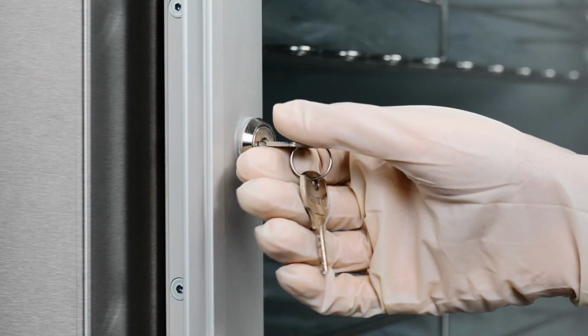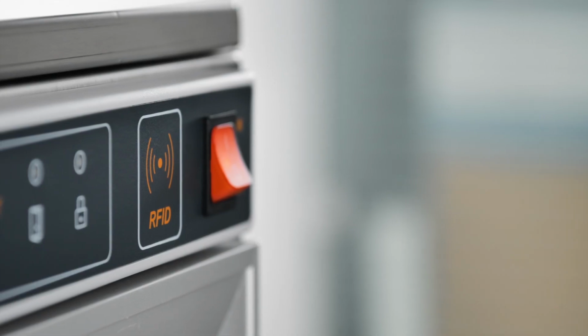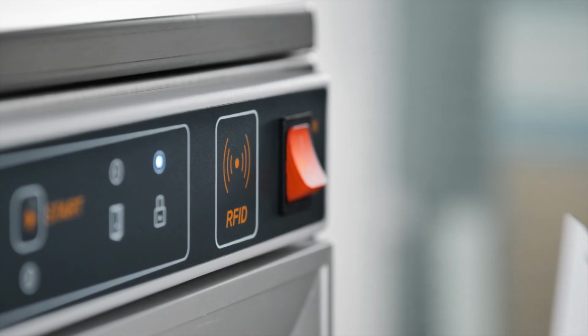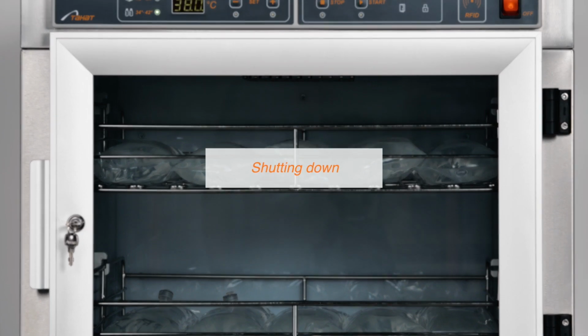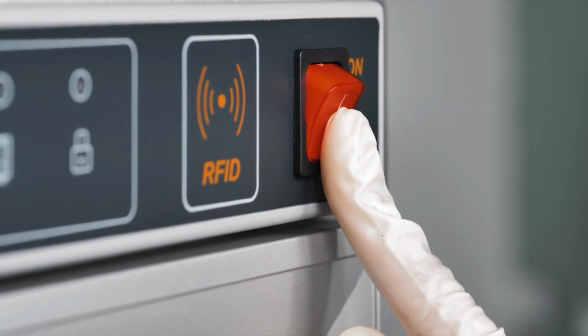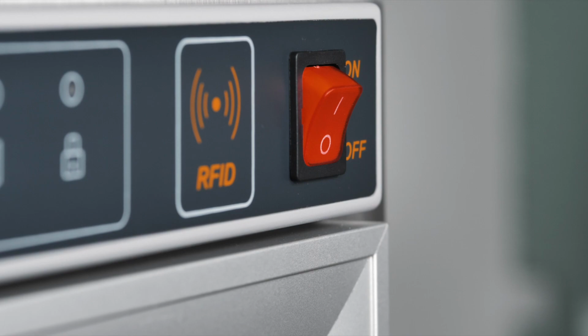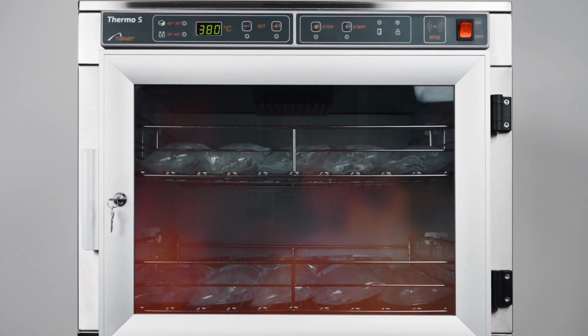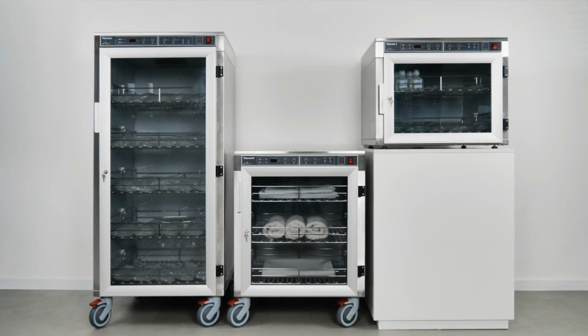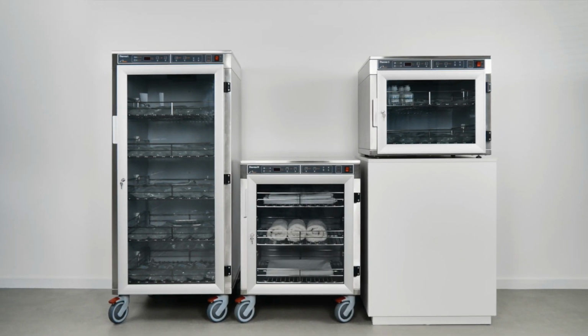Using the key, lock the door. To lock the control panel buttons, bring the RFID card to the reader. Turn off the warming cabinet. When turning on the device next time, it will resume heating according to the last set parameters. More information you can find in the user manual.